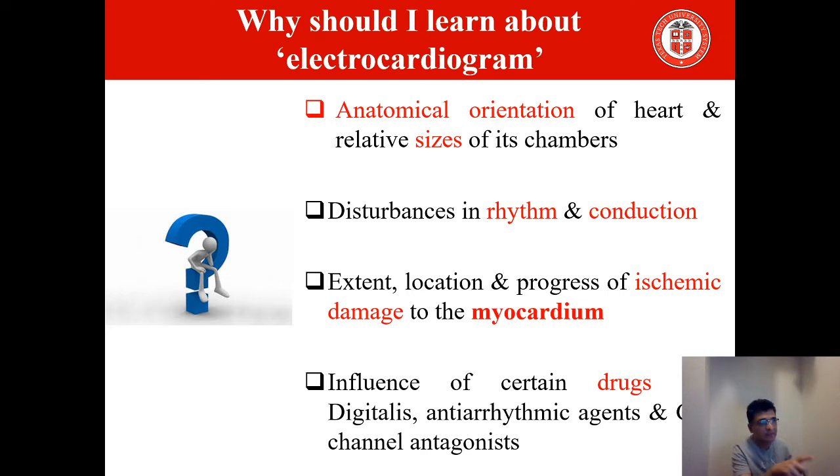It also tells us about the relative size of the different chambers of the heart, and in a lot of heart failure pathologies, we have left ventricular enlargement, which is left ventricular hypertrophy. We can diagnose it with the help of an ECG.